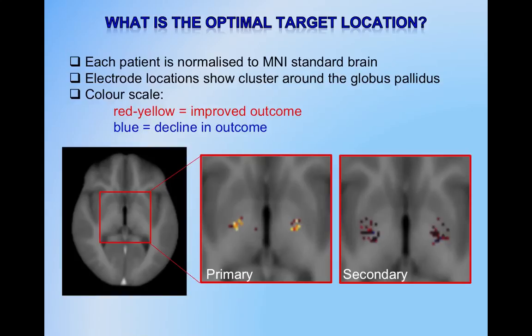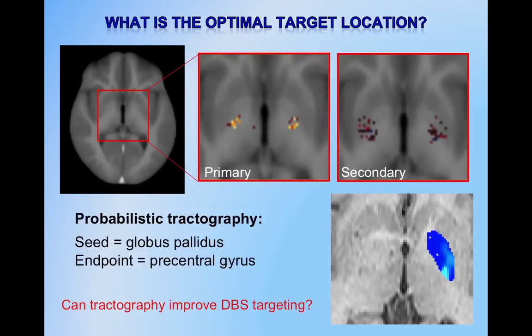And so the other thing that we've done is we've actually run probabilistic tractography. Because it's a movement disorder, we're certain it's a problem with the movement network within the brain. So the movement network goes from deep brain structures like the subthalamic nucleus, thalamus, globus pallidus, up to the cortex and creates a bit of a loop. So by targeting the globus pallidus, you're targeting somewhere in the motor network. But the globus pallidus kind of has white matter connections to lots of other areas as well.